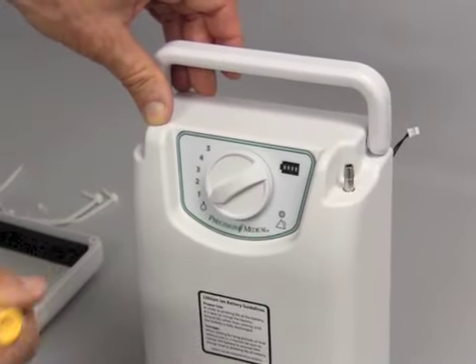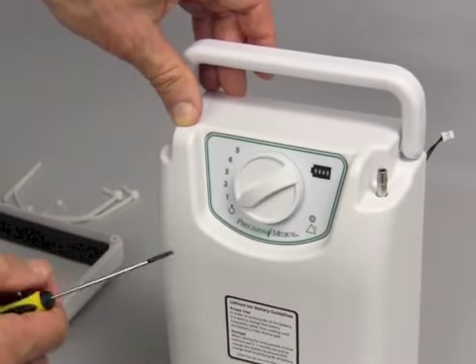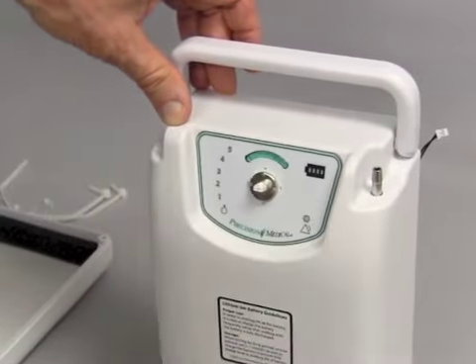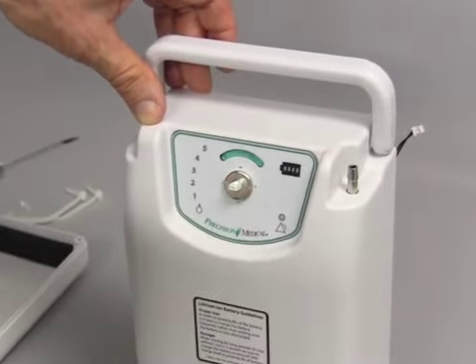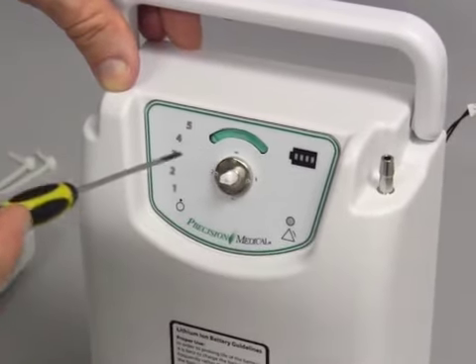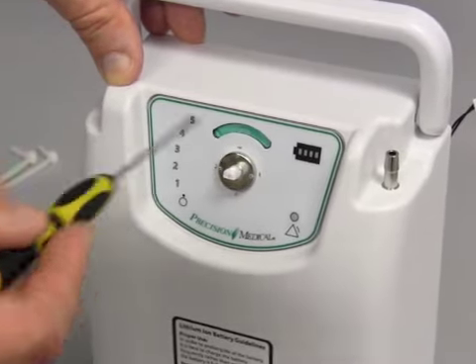This step is if we need to replace the control assembly for the POC. The first step would be to remove the knob and set that aside. And then the whole assembly here would have to be pried away with a flat blade screwdriver to replace it with a new one.